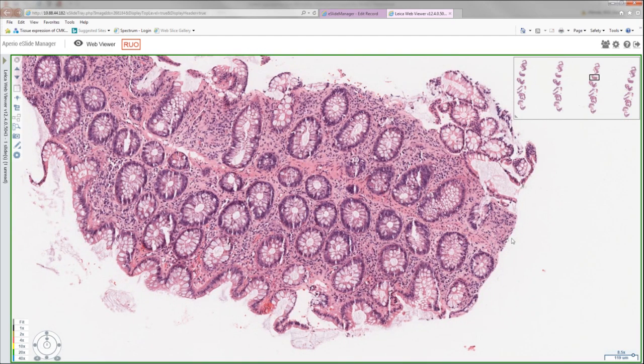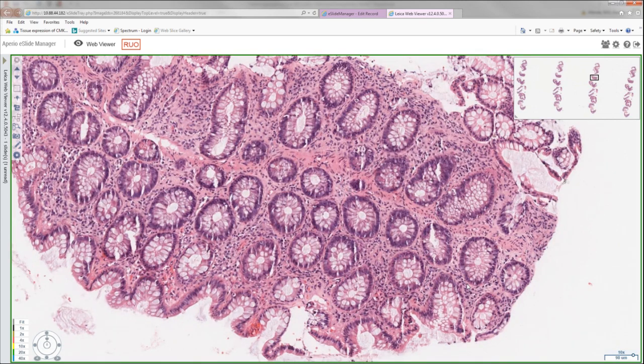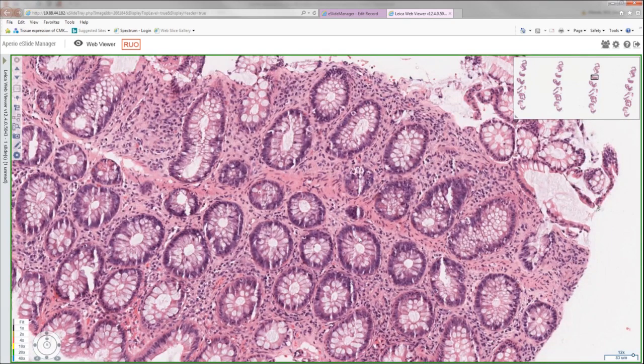So these cases can be challenging. I think these cases require more time, and we have to get a little closer to find the diagnostic features, because if you go quickly from the low power, we may consider this a pretty normal biopsy. Despite the shattering artifact that you can appreciate, I think everyone can see here that there's some apoptosis.